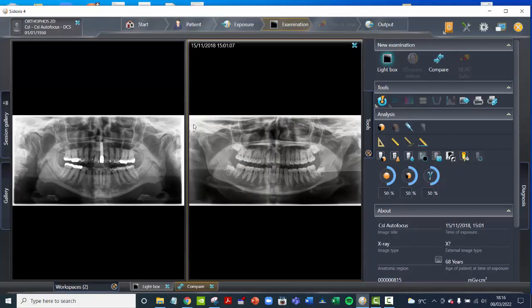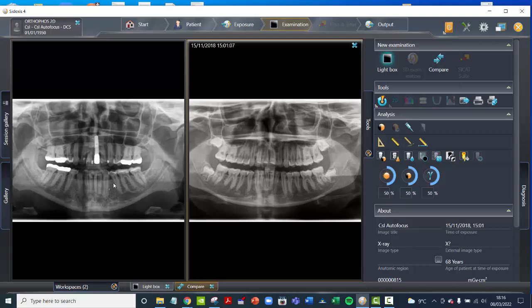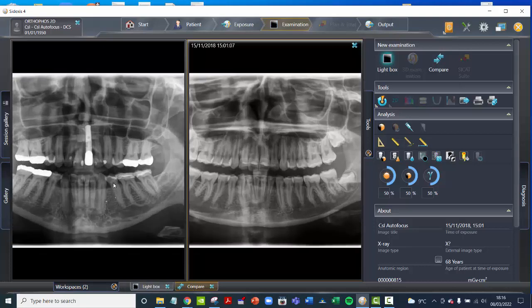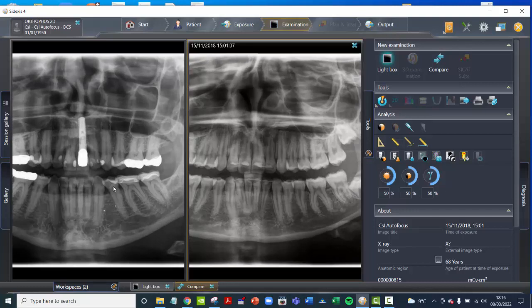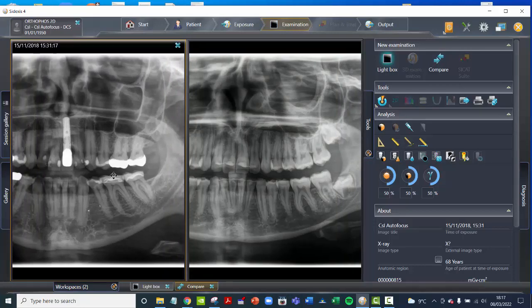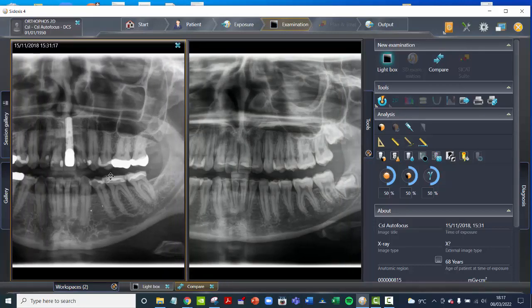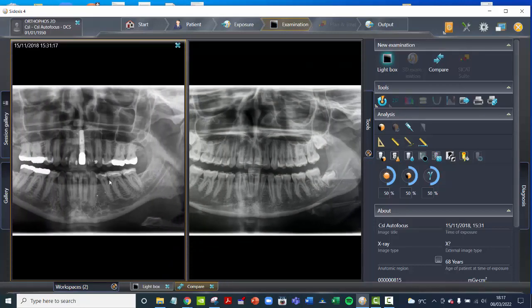Now we've got two OPGs side-by-side and we're in the Compare space down here — the Lightbox is where we were before, we're now on Compare. If I place my cursor over one of these images and scroll in with my mouse wheel, I'm scrolling in on both at the same time. And if I hold down my right mouse button I can move it around like this. So I can scroll in and out like that.